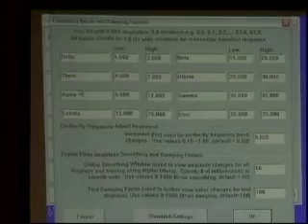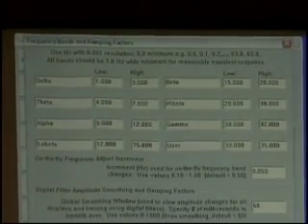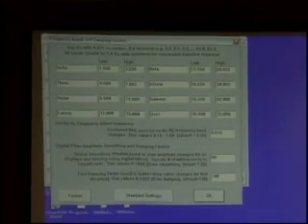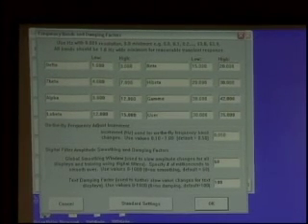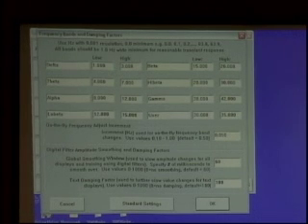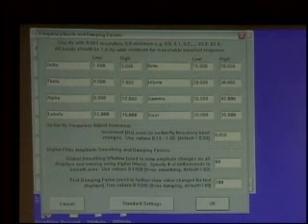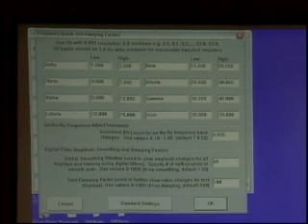So we hit OK. Next thing we look at is frequency bands, and we've seen some changes in the last couple software updates with this particular window. Now, you had your default set to eyes closed for Z-score training — is that the condition that has to be clicked for Z-score? It only applies when you put an age in the field above. Then the eyes open and close become active. So if there's nothing in there, that default will disappear?